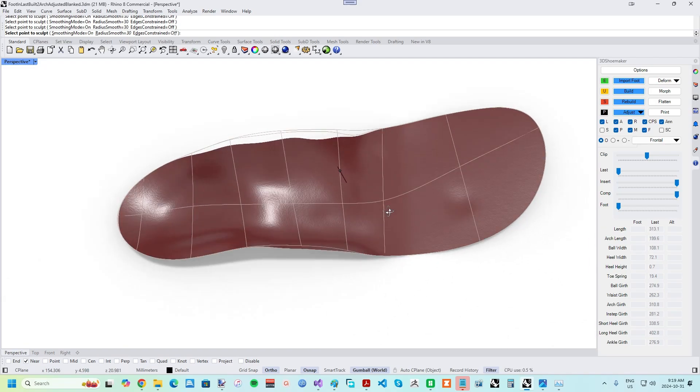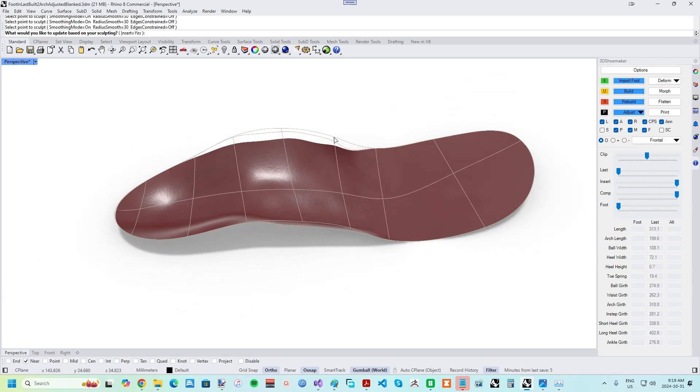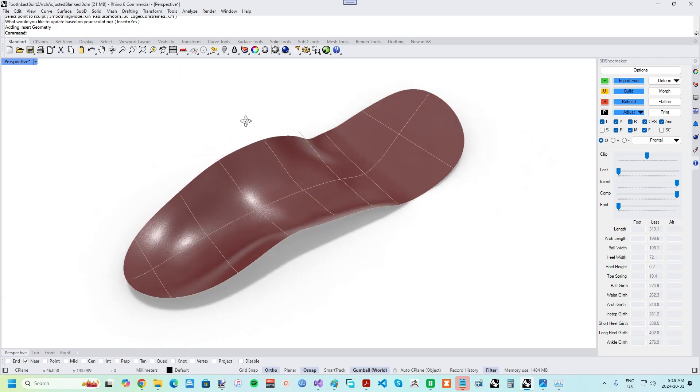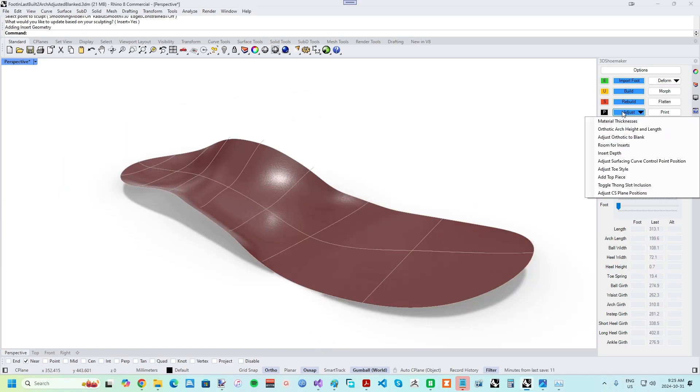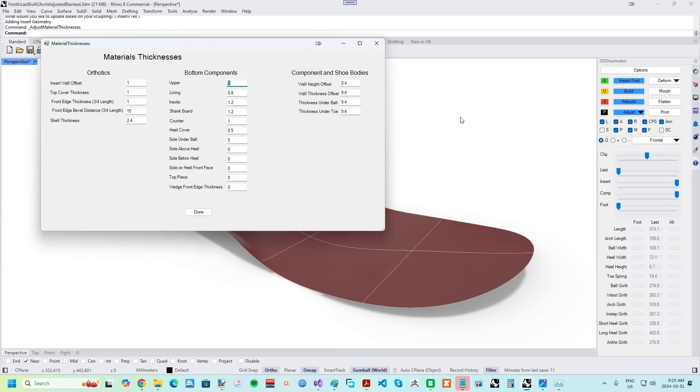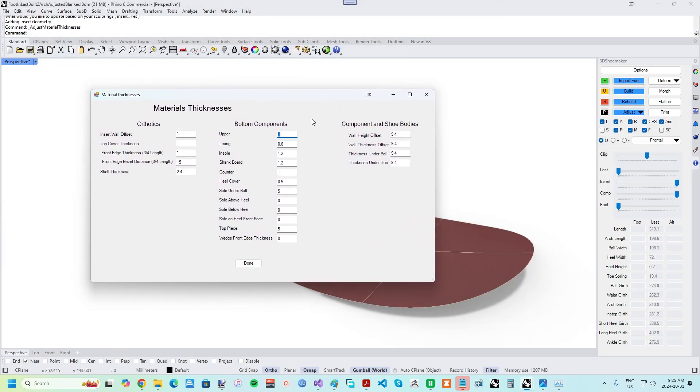Note that there are some adjustments best done before Vacuum Forming, like hindfoot and forefoot twists. Once the orthotic surface is complete, it's time to set the orthotic body material thicknesses, which are accessed via the Adjust drop-down.